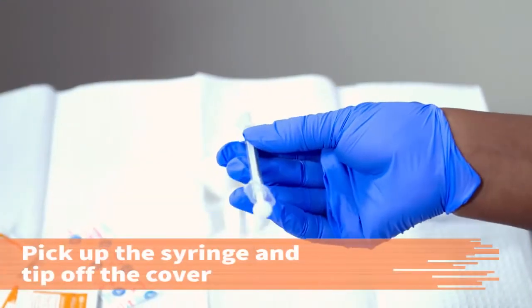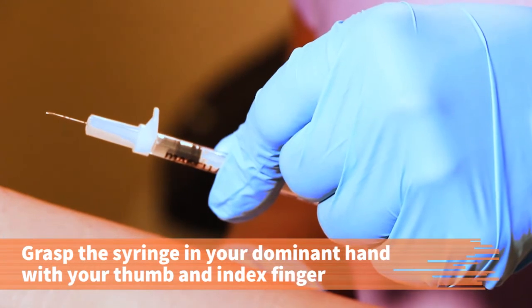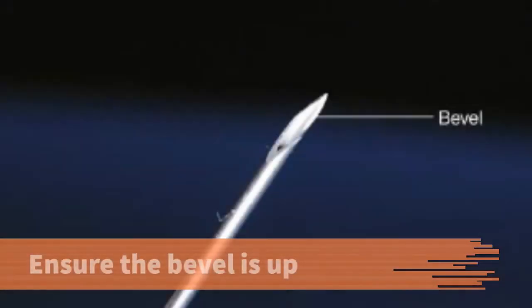Pick up the syringe and tip it to remove the cover. Grasp the syringe in your dominant hand. Use your thumb and index finger. Make sure to have no fingers under the syringe. Ensure the bevel is up.